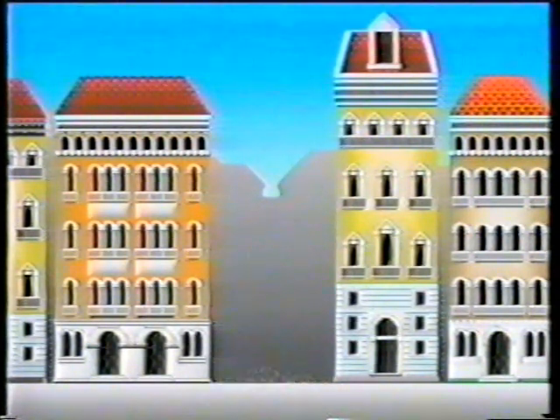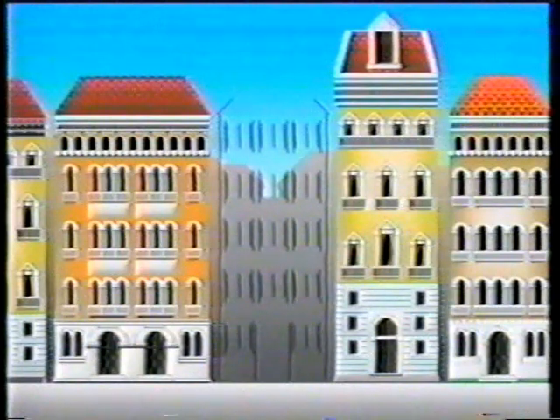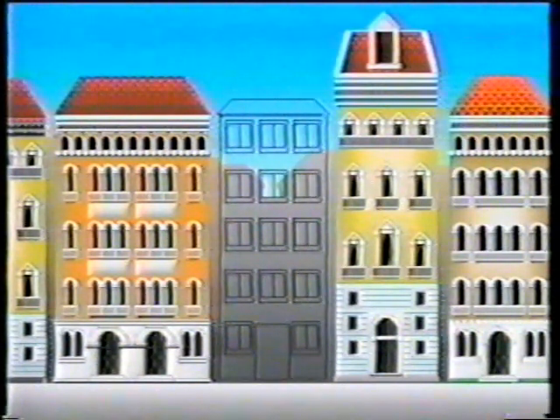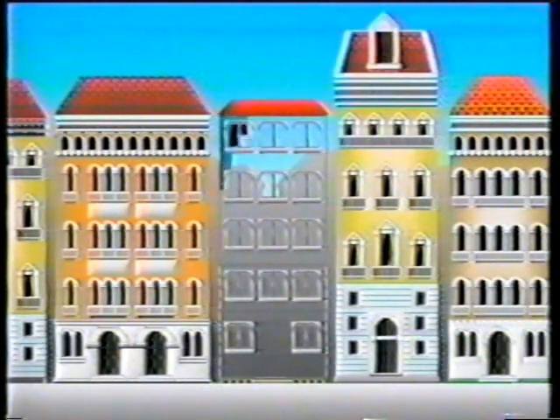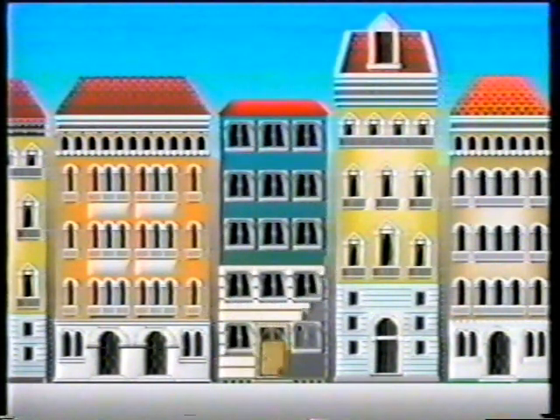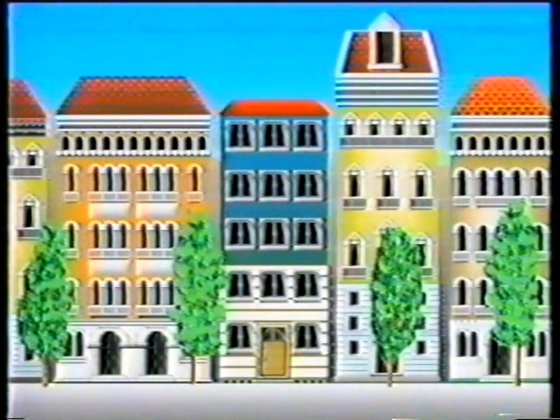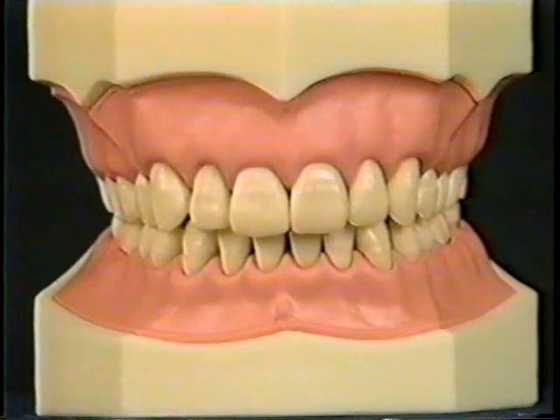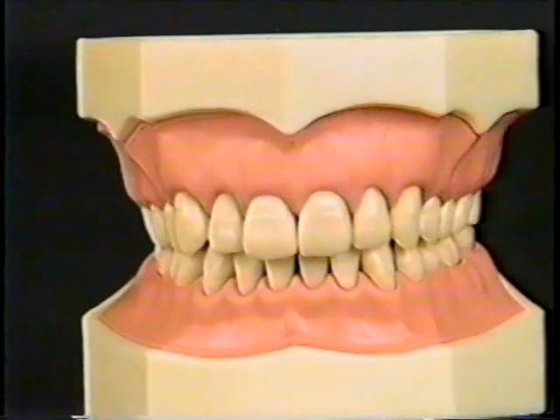Spatial reference points will be determined from the finished blueprints. After which, a metal framework will be constructed on which the outer walls can be built. As you can see, the structure's appearance is determined solely by where the designer locates these points. And in many ways, it's very similar to the technique we use to model the functional contours of teeth.